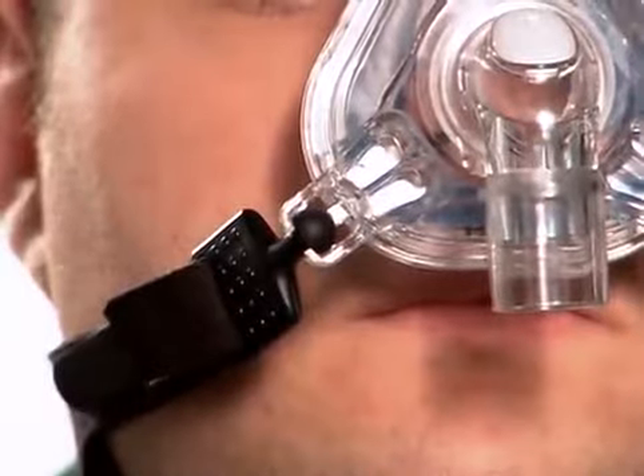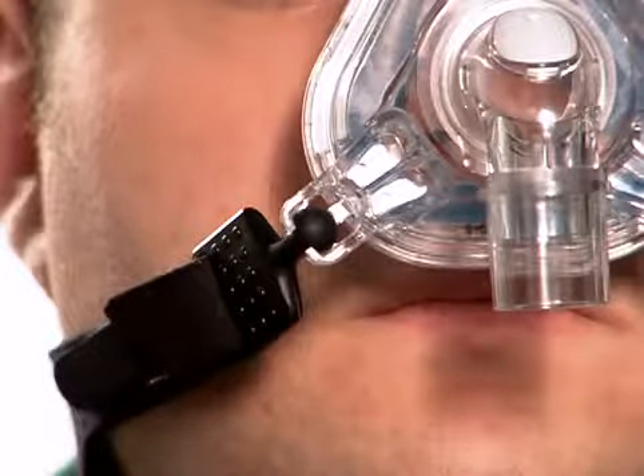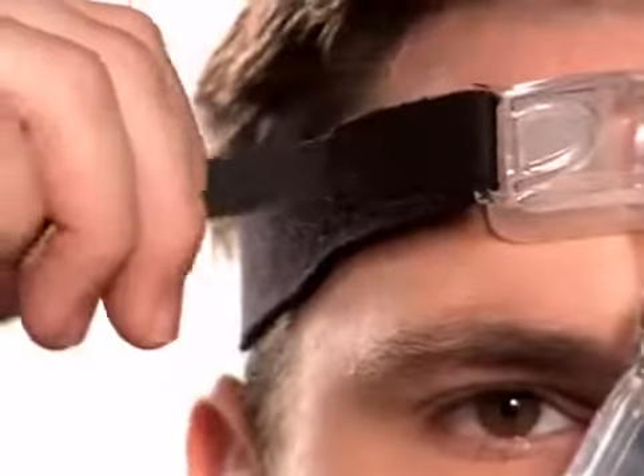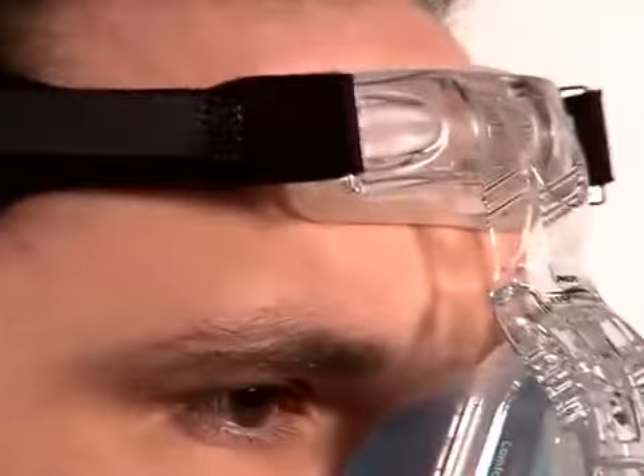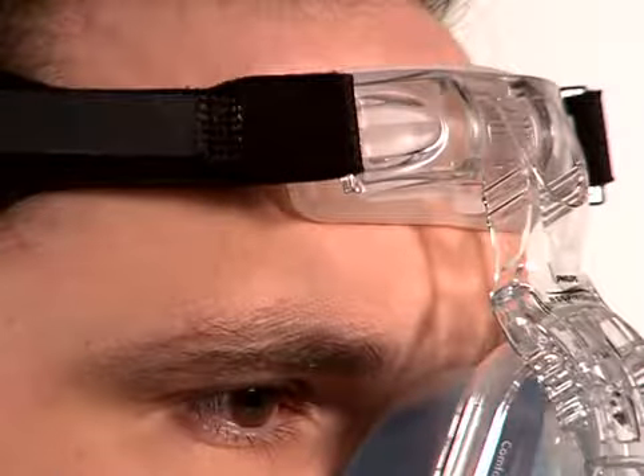You are now ready to make initial adjustments, which should be made while you are sitting up. Adjust both of the top headgear straps by using the Velcro tabs on the headgear. Be sure that they are tightened evenly and that the forehead pad is lightly touching the forehead.